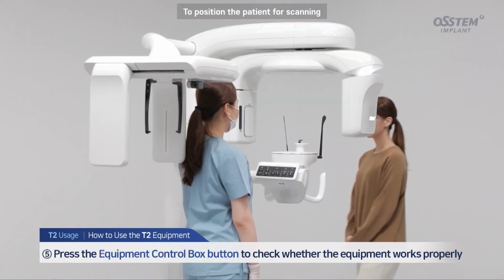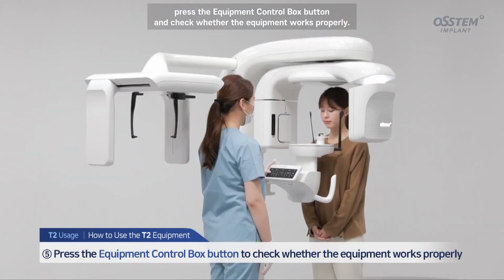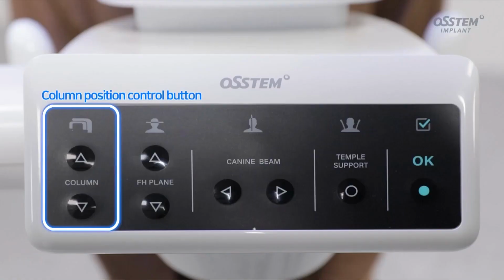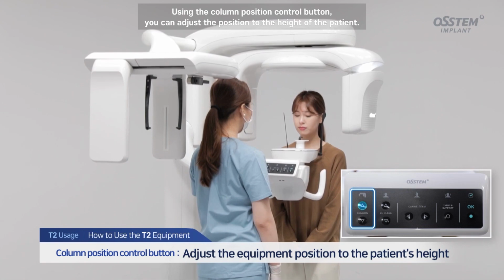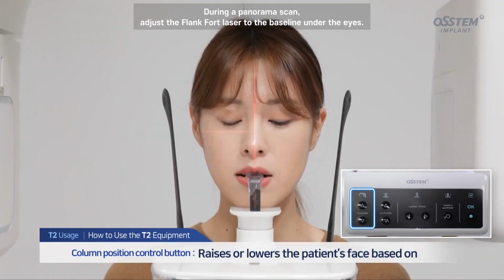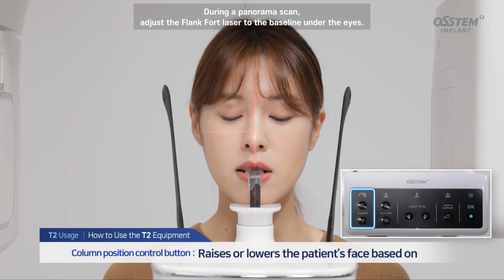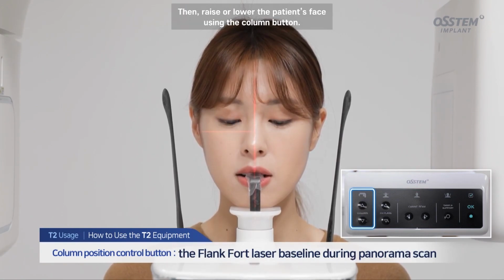To position the patient for scanning, press the equipment control box button and check whether the equipment works properly. Column position control button. Using the column position control button, you can adjust the position to the height of the patient. During a panorama scan, adjust the Frankfurt laser to the baseline under the eyes. Then, raise or lower the patient's face using the column button.